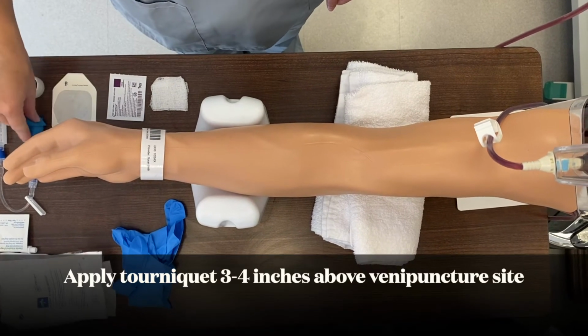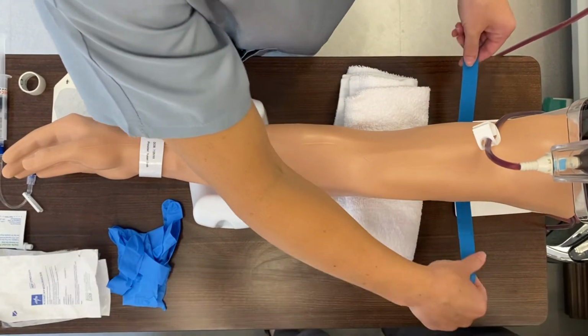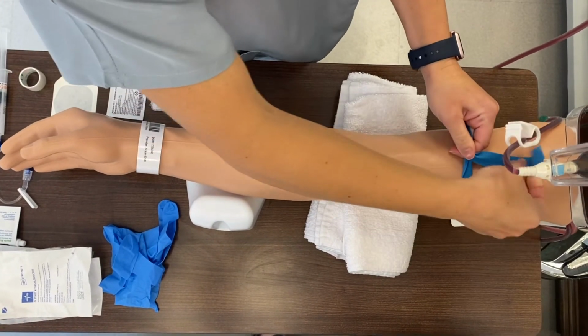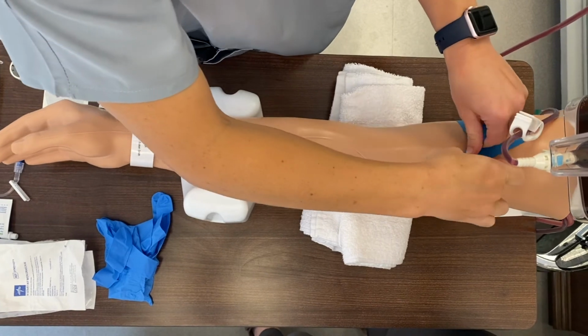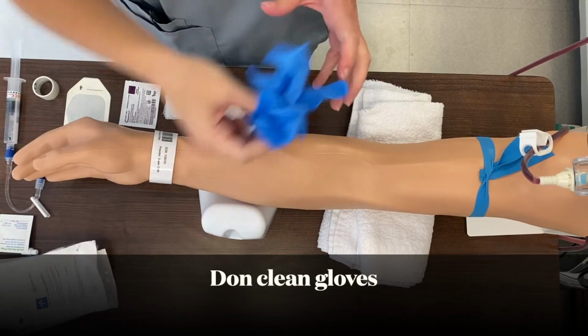Apply a tourniquet 3 to 4 inches above the venipuncture site with ends of tourniquet pointing away from the entry site. Don clean gloves.